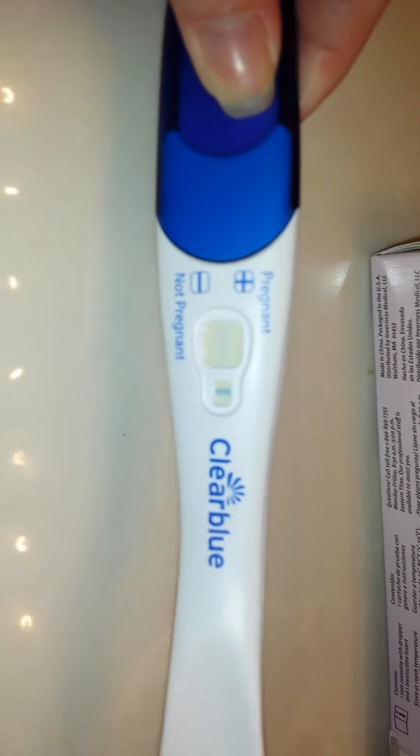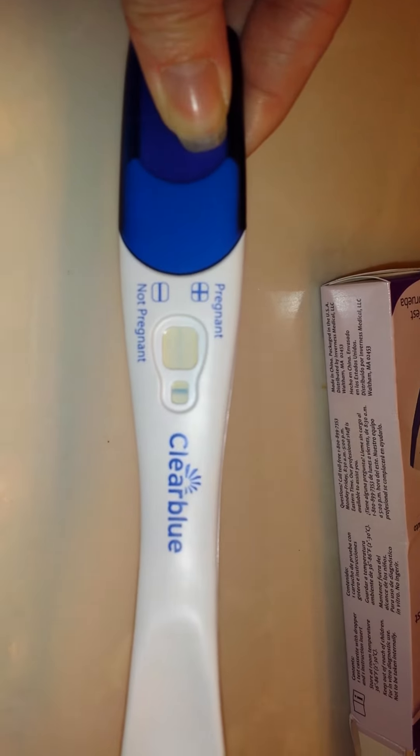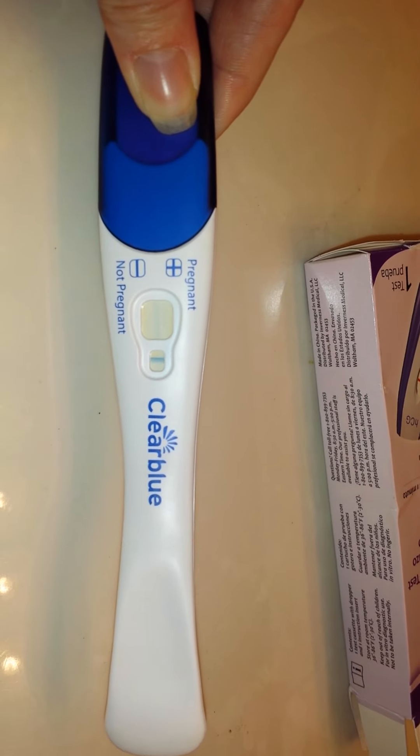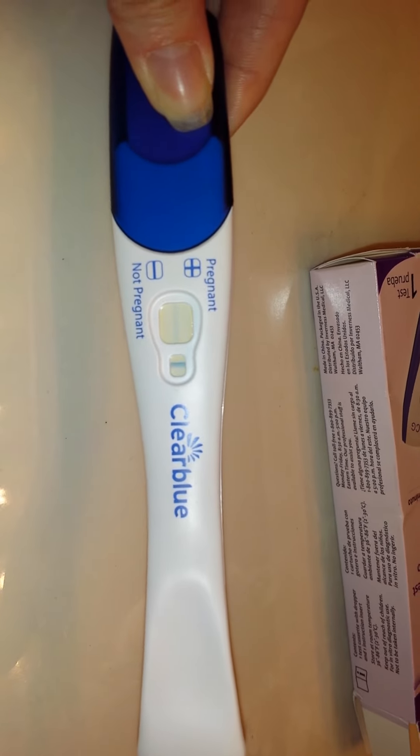As you can see, I used a Clear Blue Easy and it appears to be negative, which I did this a couple days ago only because I was trying to see if I possibly had a miscarriage and if a pregnancy test could detect HCG from a miscarriage, because I have my tubes tied. Then I just kind of thought, I wonder if you could reuse the same pregnancy test. I just thought we would do a little experiment here.